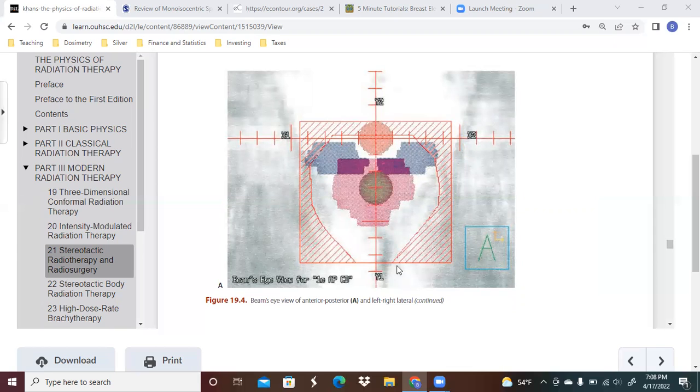Now, this is something that you simply take and you can draw bit by bit as you go around, or give it a set expansion. And generally, when it comes to 3D planning, you're going to set your beam angles manually. If it's a 4-field, you're going to do an AP/PA, right and left, that kind of thing. And also the fields don't really change. The only exception to that is if somebody puts segments or step and shoot into their plan in order to try to cool certain spots down.